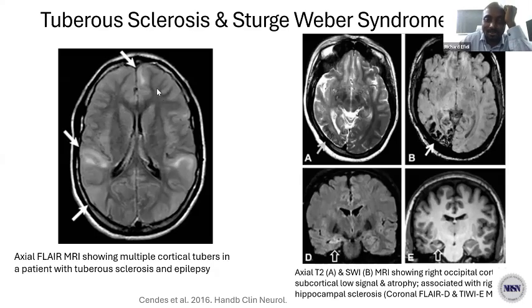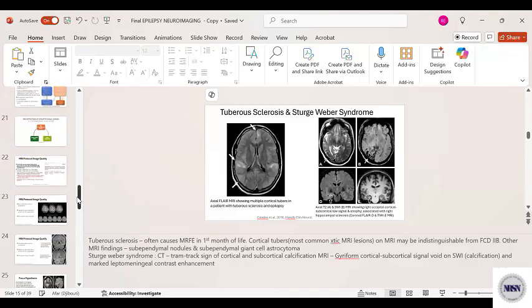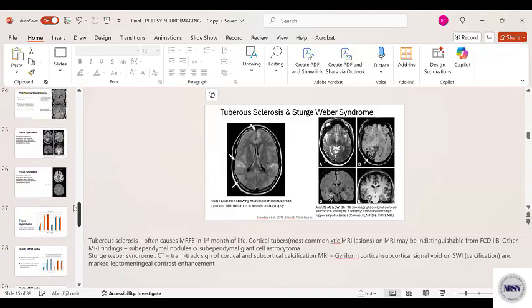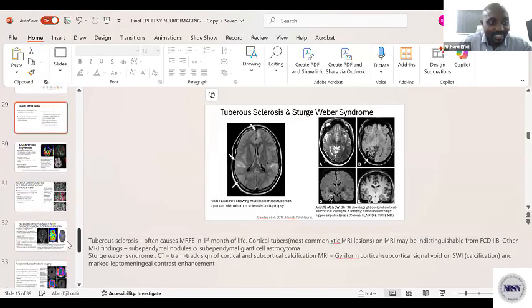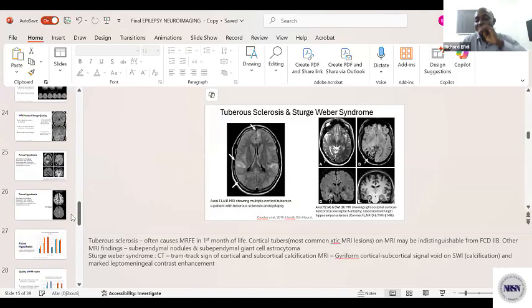Okay, so for the second question, hippocampal axis and... what's a minute? The question is, how do you explain hippocampal angulation? Yes, I'm just trying to show the image. Okay, maybe I don't really have a particular image.